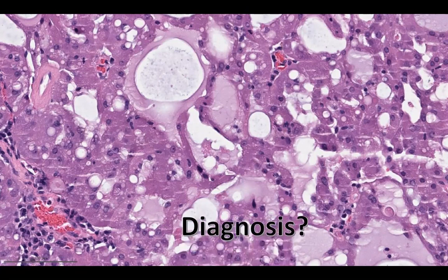What is this? I know you guys know this one. Can I try my chance? Yeah, go for it. Mucoepidermoid carcinoma. Oh, bro, you're finally wrong. Oh, that's good. It's not, but that's a good guess because there are these secretions here which almost look like mucin. I'm sorry, no, you are killing it. I really appreciate it. And that is a good guess.